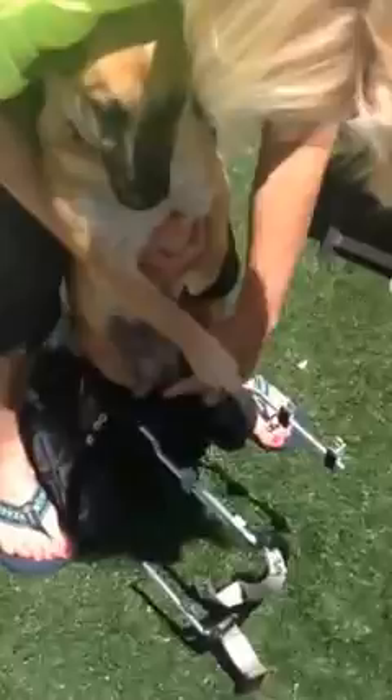Open this up. Start by making sure that these two bones sit into the stirrups like this. You can reposition him more with his tail.